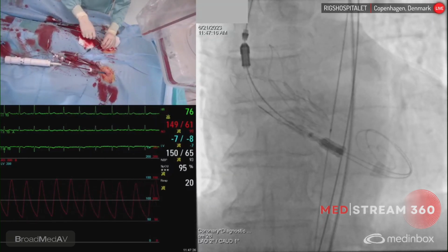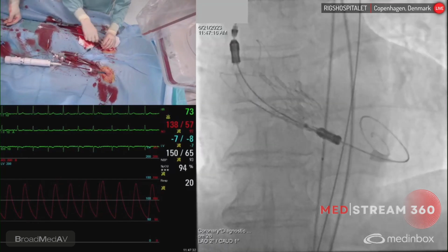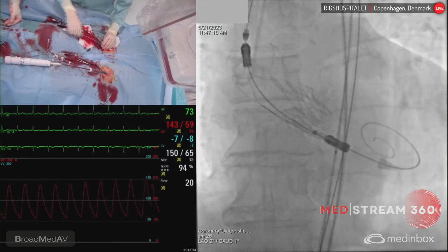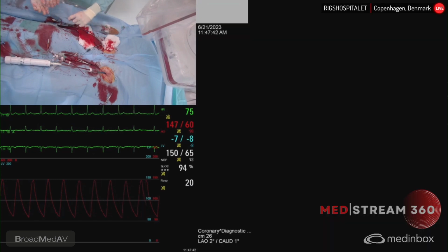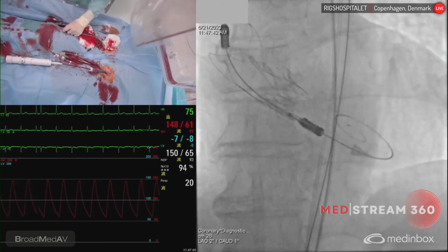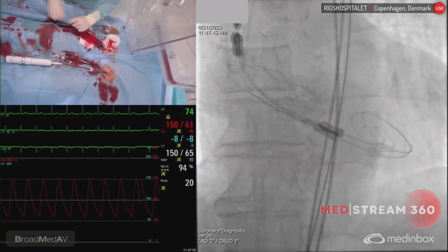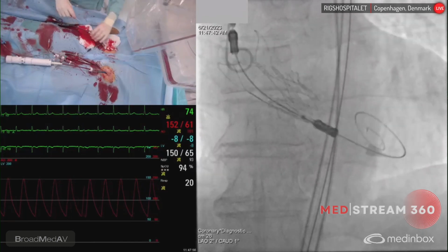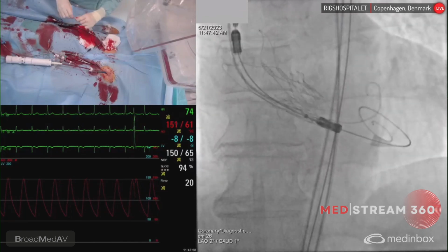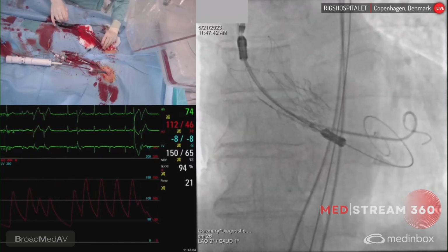But we have to be careful. You hold the wire. Hold the wire, please. Yeah. Give me then a J wire. Yeah, all right. Okay, now we cross the valve, but it should be at the inside of the valve frame. Turn it out like this. You have to be in the frame and cross it. Yeah. But we're not there yet. Now it's the matter of proof of the pudding.